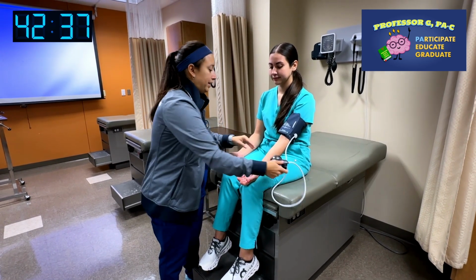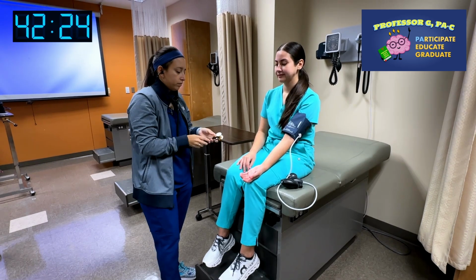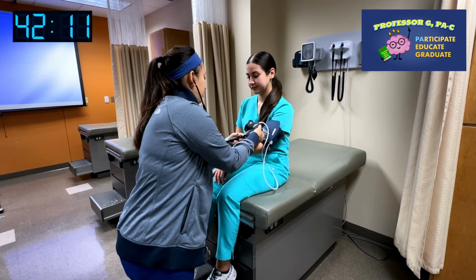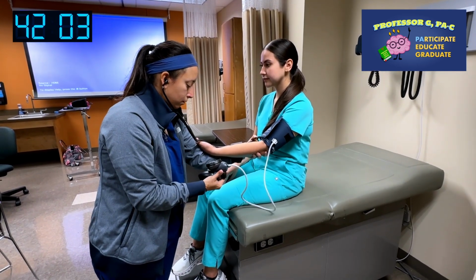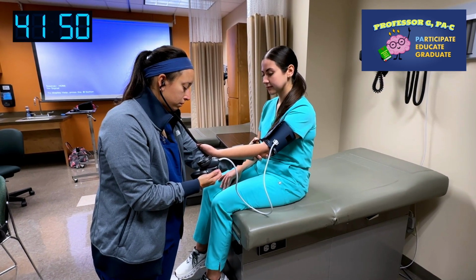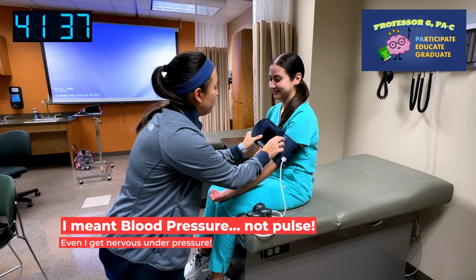All right, I'm going to let that rest for just a second. I'm going to check your pulse here. Good, you got your brachial pulse. Now we're going to check your blood pressure. So let's go ahead and rest your arm on mine just to... There you go. All right. All right, your blood pressure is 98/50. Do you usually run a little low? Yes. All right.